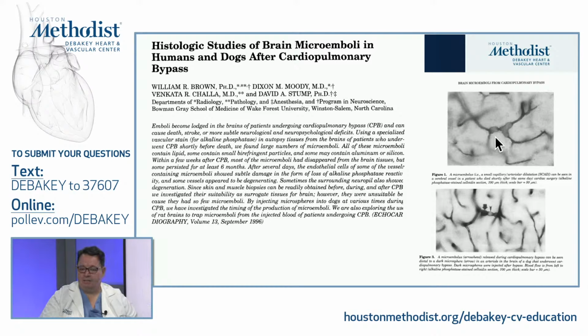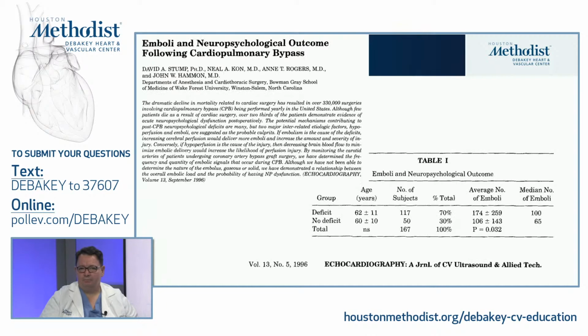Hopefully they are not stuck in those capillaries. And everybody wants to see the evidence that the microembolus signal can do something bad to you. So just a reference paper from almost the same year, same journal, shows you that when you have a microembolus signal, it shows correlation with a deficit with the cardiopulmonary bypass surgeries, again with cognitive outcome. And if you want evidence, here's your p-value as well.